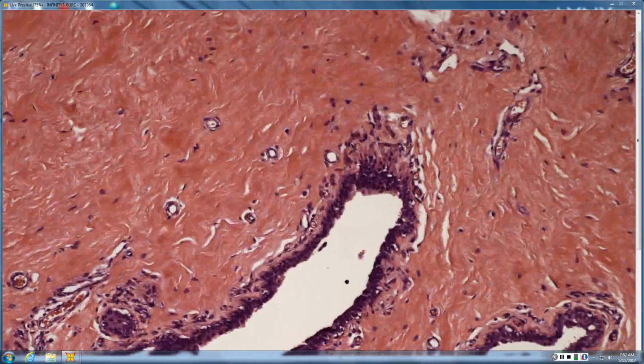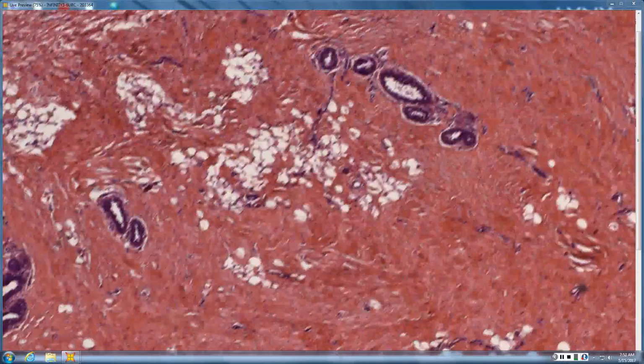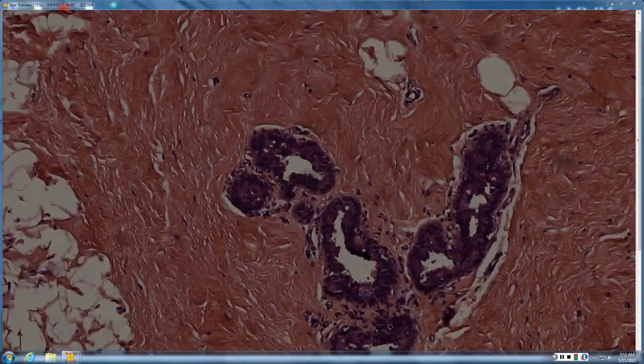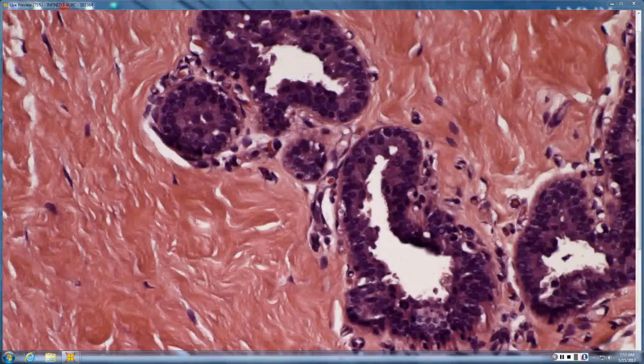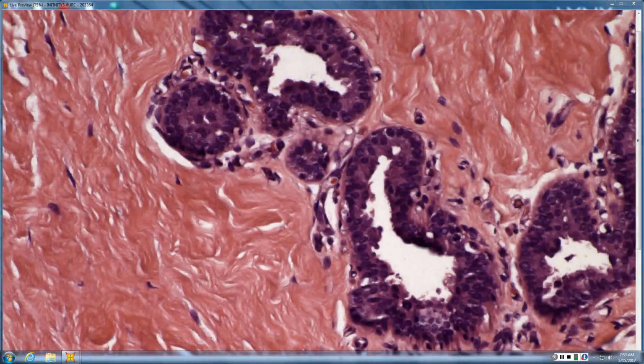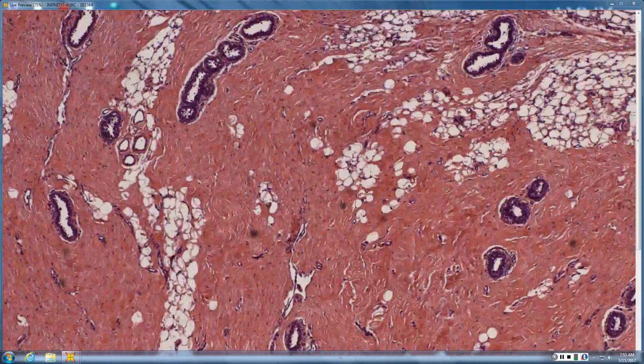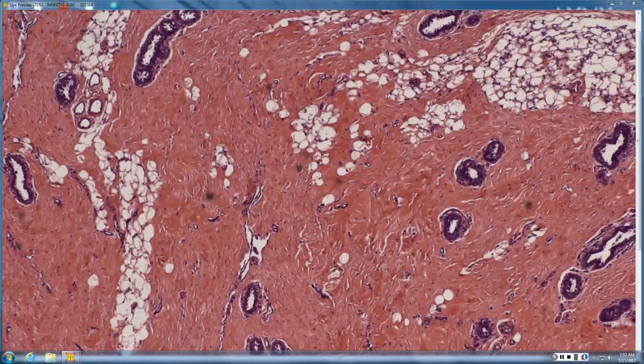The fact is that you don't have any crowded glands. They're not so haphazardly arranged; they're nicely spaced. While these do stain dark, you have to take into account that different labs stain things differently. If you look at the number of layers in the glands, you only have up to two layers and then a myoepithelial layer. They don't look pleomorphic or angulated. They also don't look monotonous like you would expect in DCIS, and you don't have the hyperplasia. That dense stromal reaction is also really good for gynecomastia. It's a little bit denser, but I liken it to fibrocystic changes you would see in a female breast. And then you need the history that it's a guy, usually at puberty, that type of age.